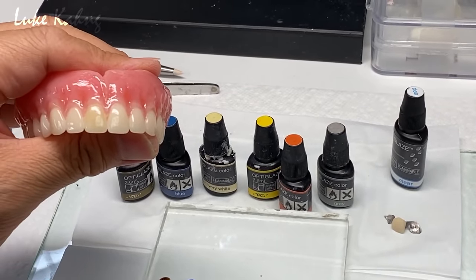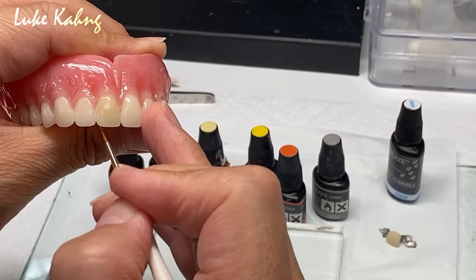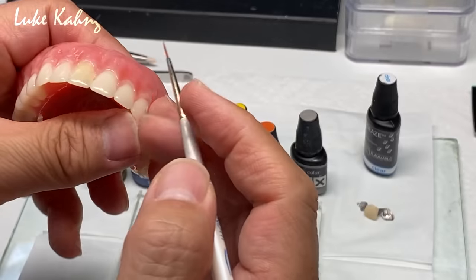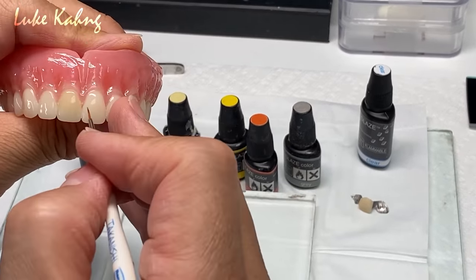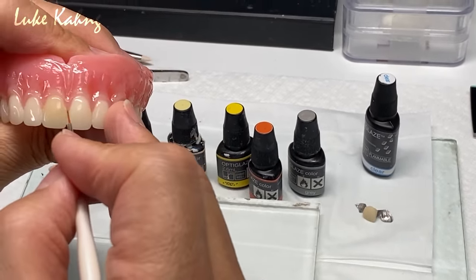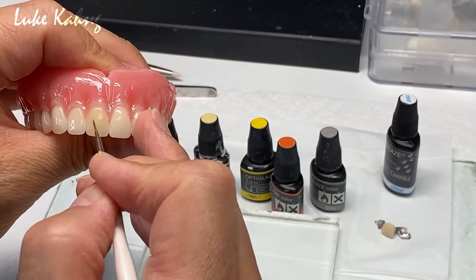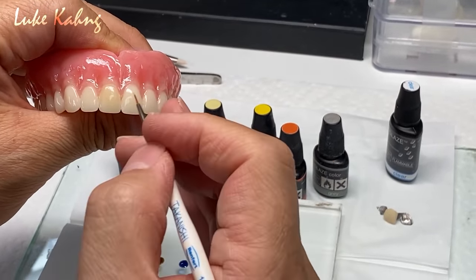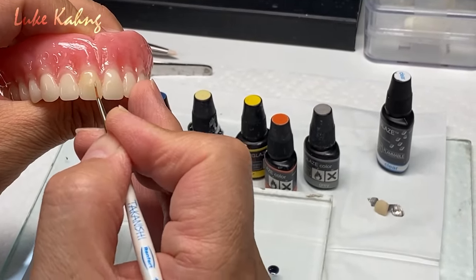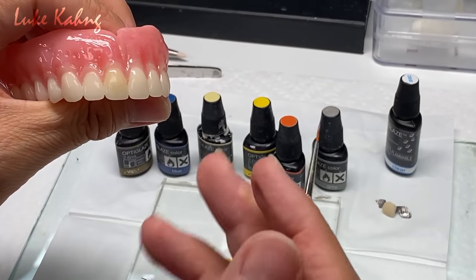And also you can do with the characteristic. So also halo, orange from between the teeth. It's very light, very, very light. Okay, so that one we can make the really characteristic horizontal line, just like that. So this is the guide to maximize the characteristic.